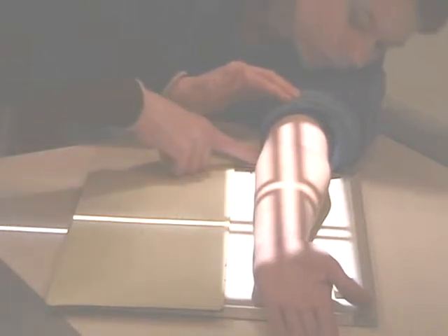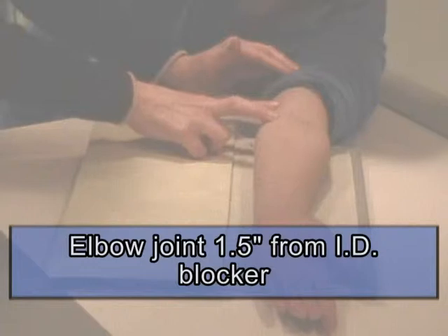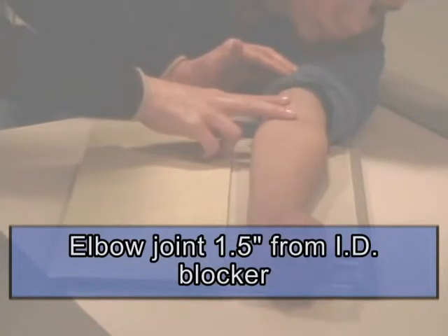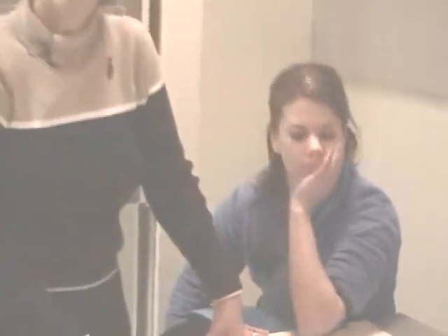Okay. There would be my AP distal forearm. ID blocker is here. Carpals are about 1.5 inch from the film's edge. The elbow joint is 1.5 from the ID blocker. Okay. If I did a good job of shooting this x-ray, I'm going to let her relax now because it's not comfortable. If I did a good job positioning this in an AP position, the distal ends of the radius and ulna will barely touch, if at all, and the proximal end of the forearm will have the radius and ulna slightly superimposed.